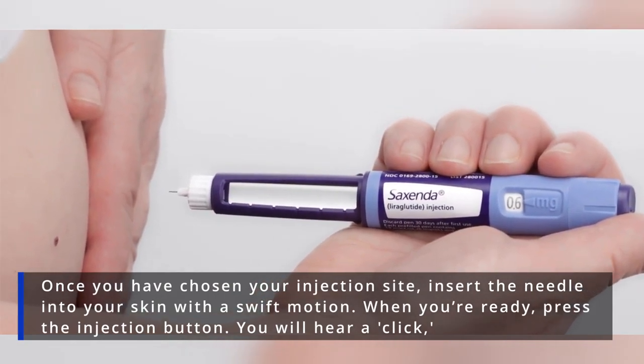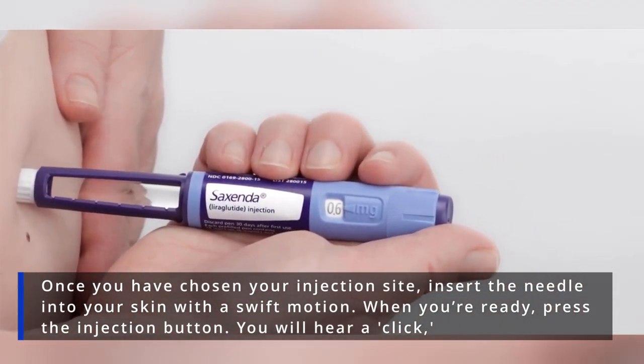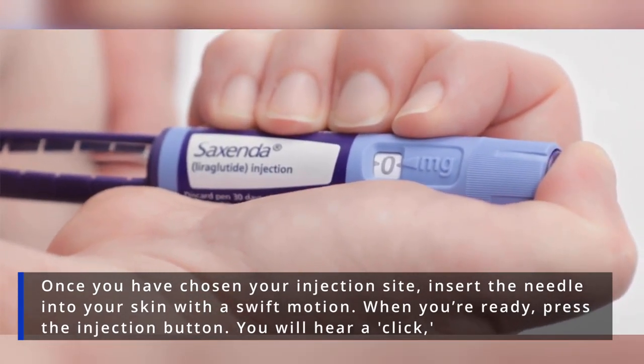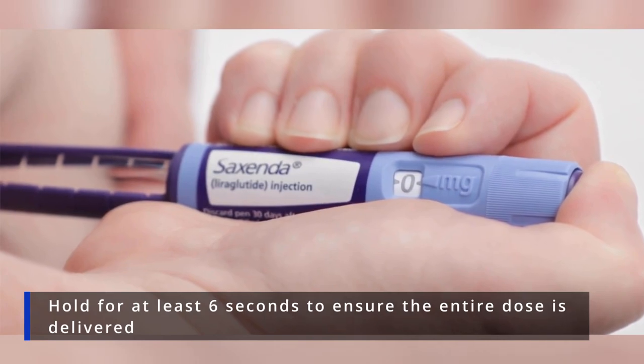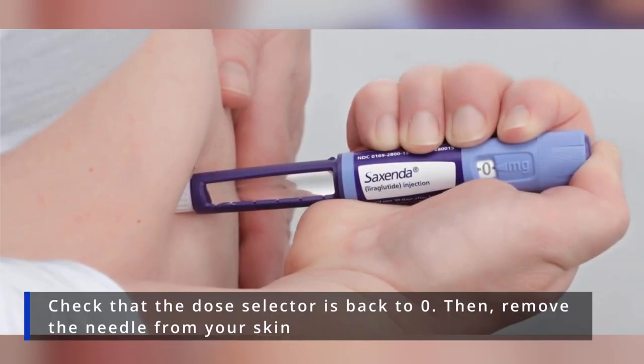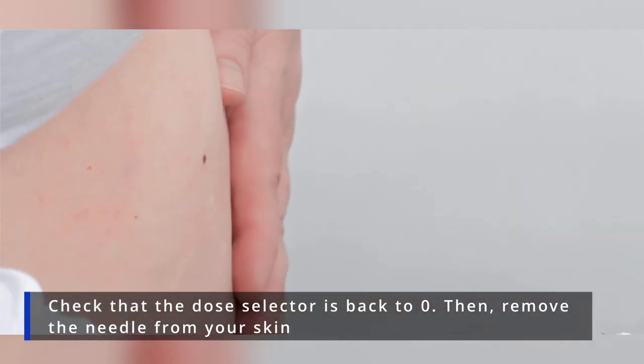Step 6: Inject your dose. Once you've chosen your injection site, insert the needle into your skin with a swift motion. When you're ready, press the injection button — you will hear a click. Hold for at least 6 seconds to ensure the entire dose is delivered. Check that the dose selector is back to zero, then remove the needle from your skin.